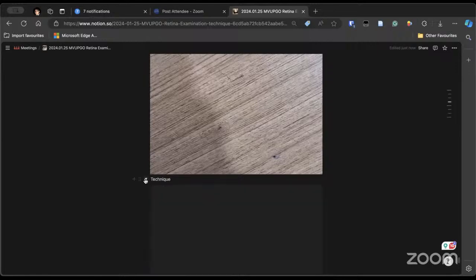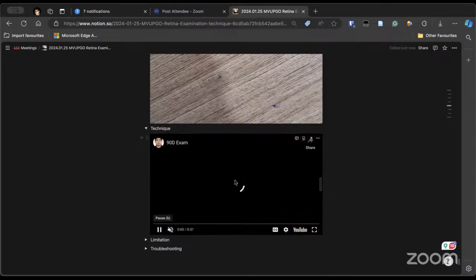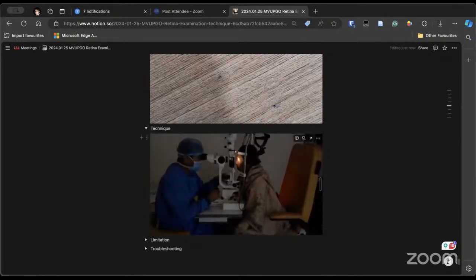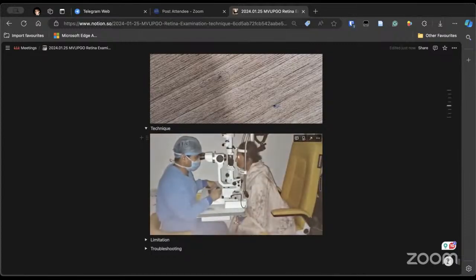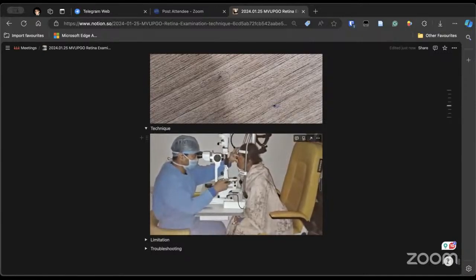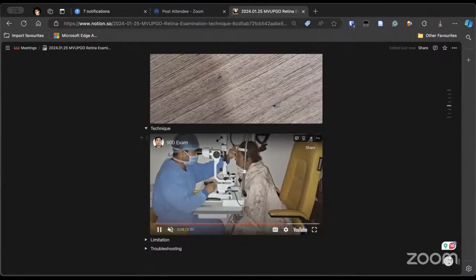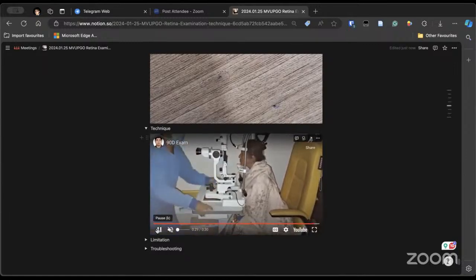So the technique, I think everybody is doing. Obviously, greet the patient, sanitize your hands, then ensure that the patient is seated comfortably. Then you have to examine the anterior segment first, so that you know whether there is an opacity or not. It can take a little time, but it is a good practice before 90D, and in examination also, you just have a look at the anterior segment and then start. Then you bring the illumination to the center so that the light is there, and you examine.